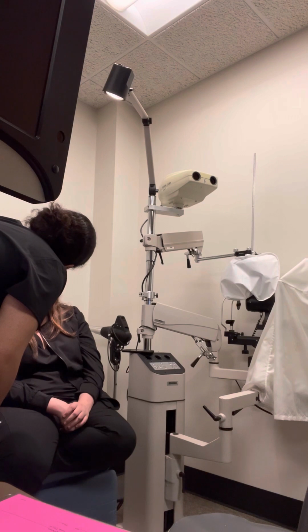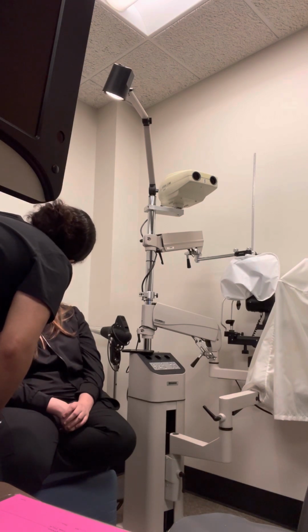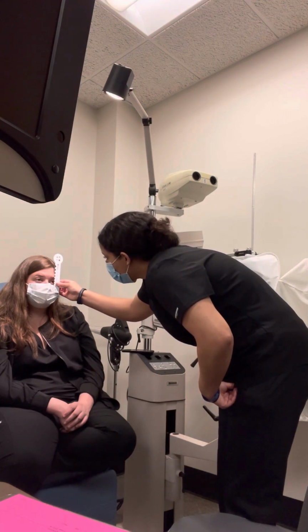Try your best to read the lowest line you can out of those. HPV BUE. Now cover your other eye, and HPV BUE.